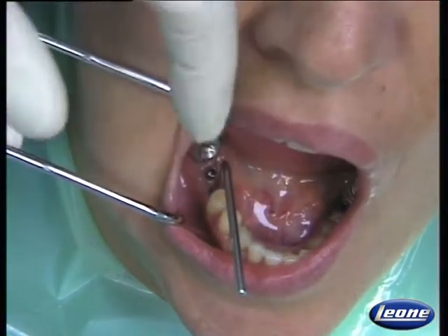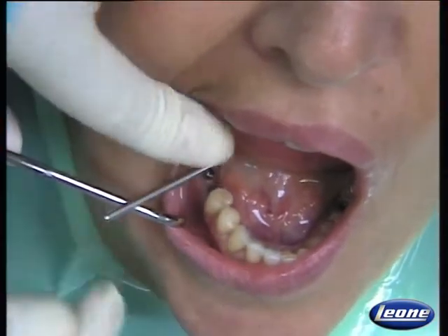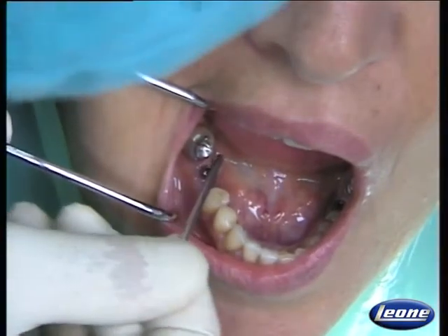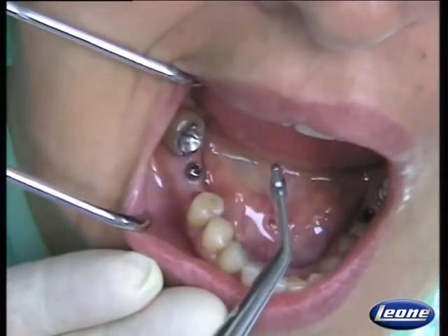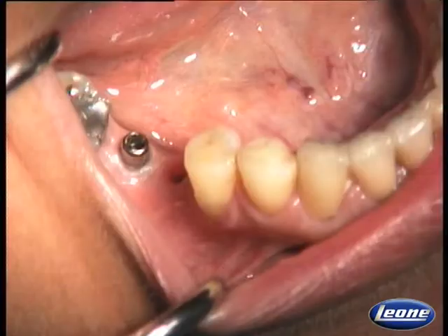The extractor is seated into the hex on the head of the healing cap. I position a finger on the extractor and rotate for 1/2 turn. The healing cap is then unlocked. Once it is unlocked, we remove the cap with the tweezers. Healing caps have a shorter Morse taper than abutments, and they do not have a hexagon.